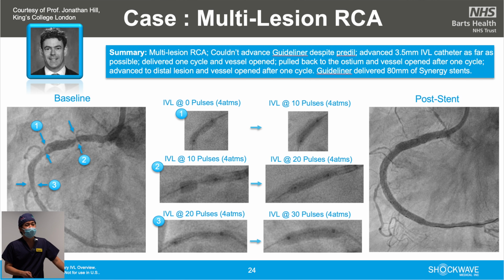I remember this case actually. At King's, they were the first one to use shockwave like 4 years ago. And they did a CAD research study because this was a new technology before. So you need a center to try this out. So King's was the first one to do it around 4 years ago.